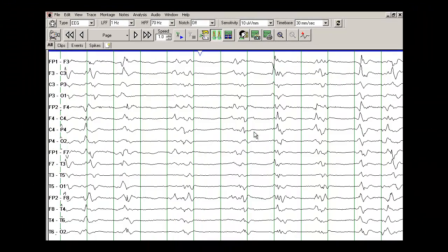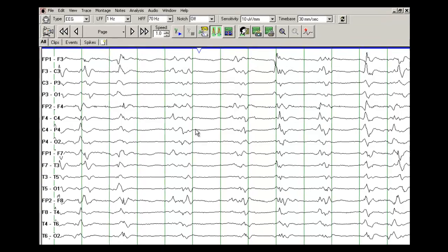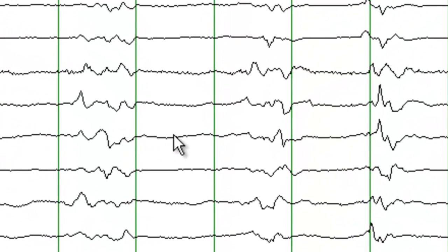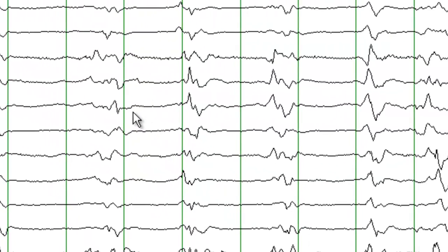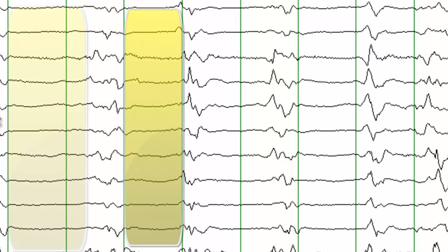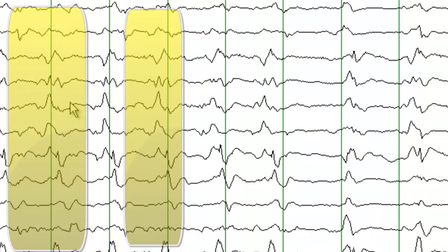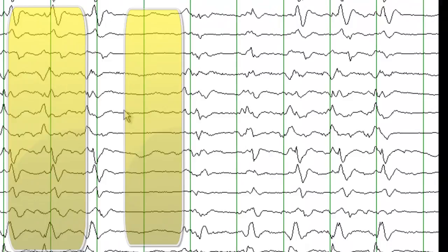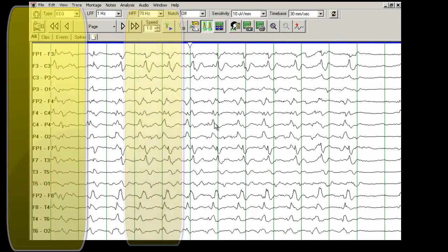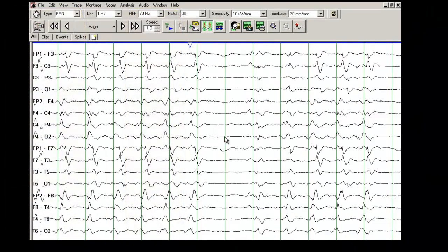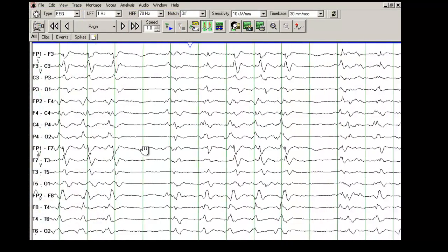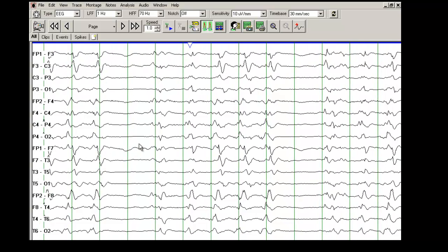And we will proceed on. The other noticeable finding on the EEG is these periods of suppression that last anywhere from one to one and a half seconds right here. So we will move on. And you keep seeing these suppressed amplitudes. When we say suppressed amplitudes, if you measure the amplitudes here, these are less than 5 µV.